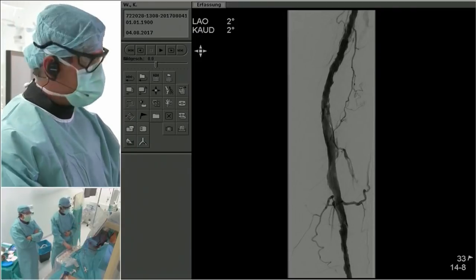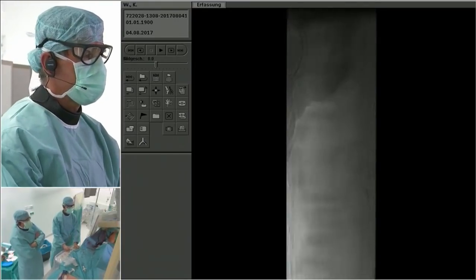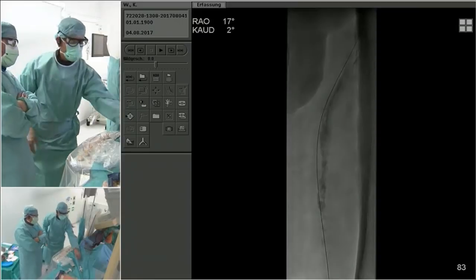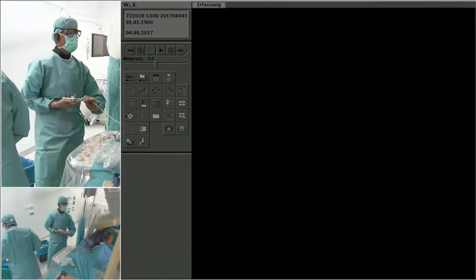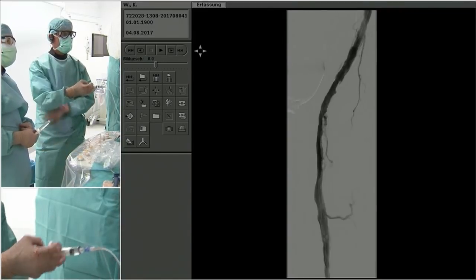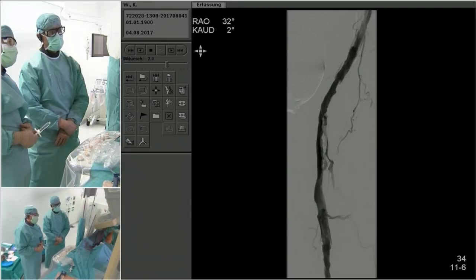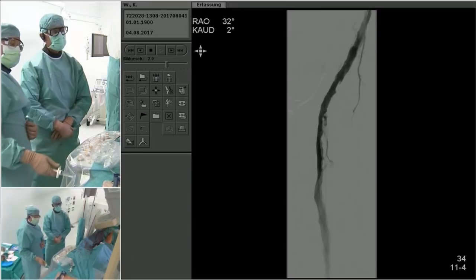But here, in fact, we may not need the Viabon. We may just continue with the Supera stent. I think I do another angulation here to rule out any really severe residual stenosis. I think without any significant perforation, Supera would be nice here. But why does he need anything? Supera, yeah. There's some recoil. I mean, this is not perfect.